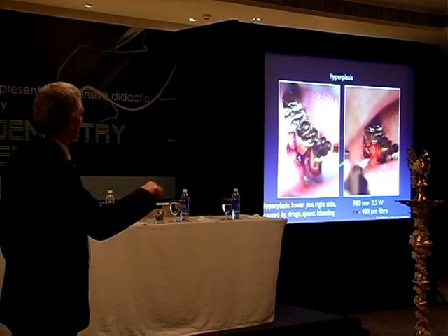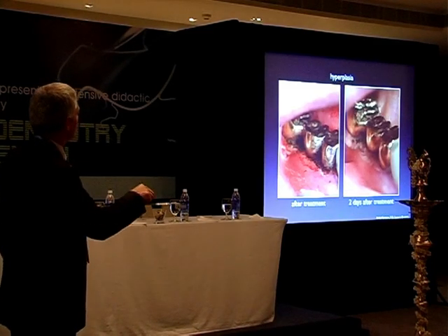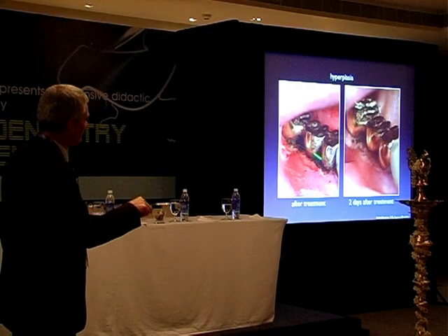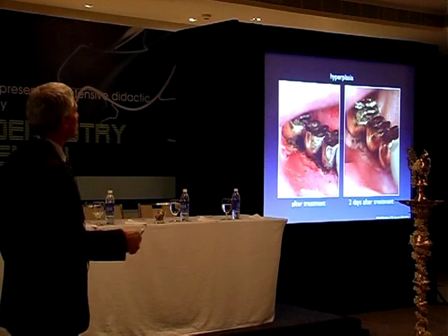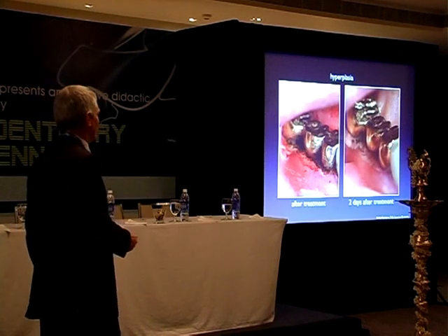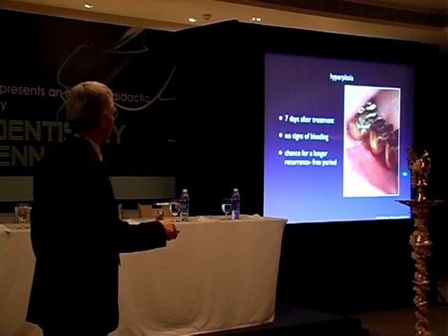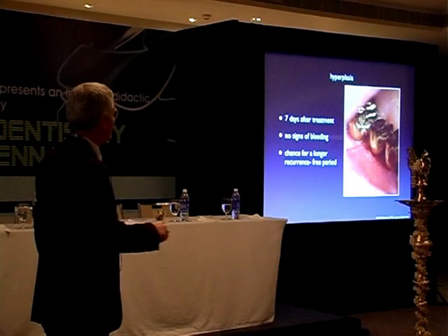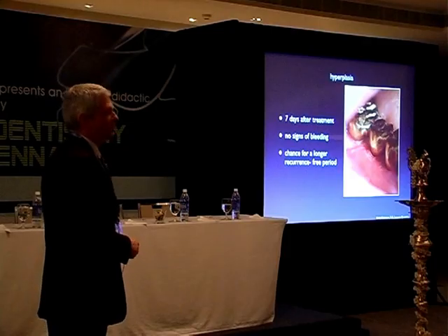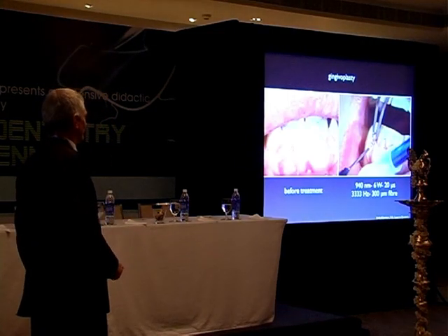So this time I treated it in continuous wave mode. You can see it afterwards. You have a little bit of carbonization, but in this case it's not bad because you want a long healing time to get a longer recurrence time. This is 2 days after treatment, and this is 7 days after treatment. It's looking nice again, and now you have the chance for a longer recurrence-free period because you used such a high amount of thermal damage.